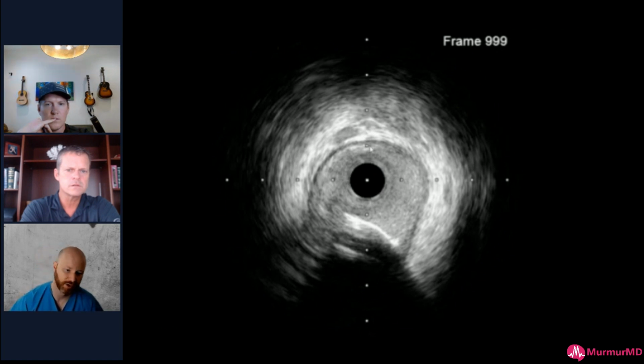media to media. You can also take the luminal size and use that as a one-to-one, but I don't like that, especially with these huge nodules, because you just never really find the best normal part. And so I sized this to media, and then came just down a tiny bit on size. And I frequently actually use shockwaves at the media to media side, because you're at such low atmospheres, and I really want to maintain apposition. And I don't want to be floating in any portion.